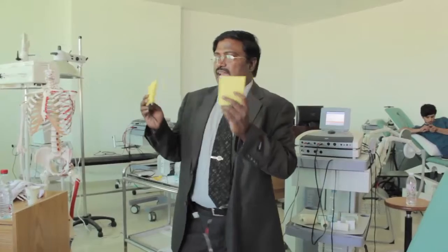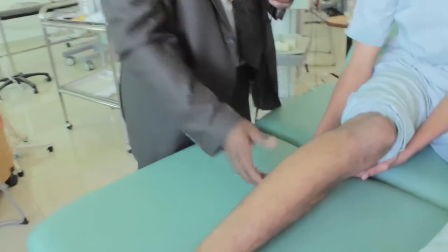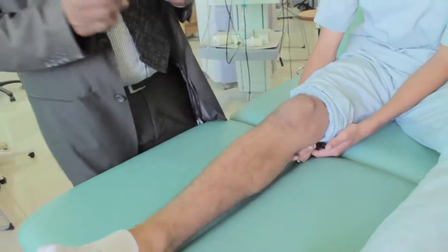Can you remove your shoes? Now I have chosen Russian current for strengthening the muscle. Because the electrode size is big, I am choosing groups of muscles and bigger muscles. I have chosen plantar flexors or dorsiflexors. Either of them we can stimulate.